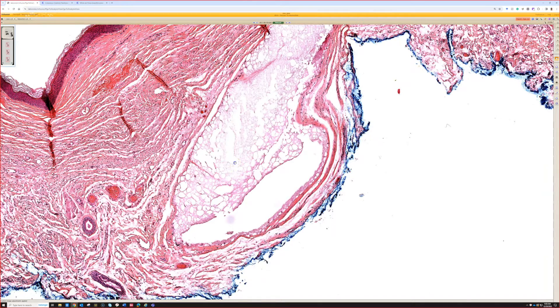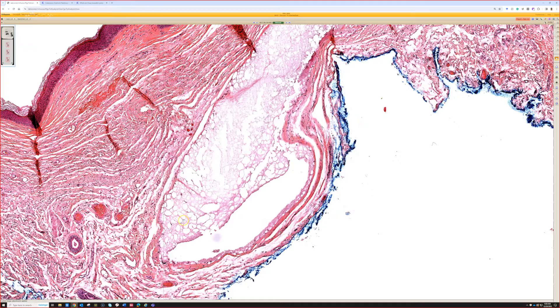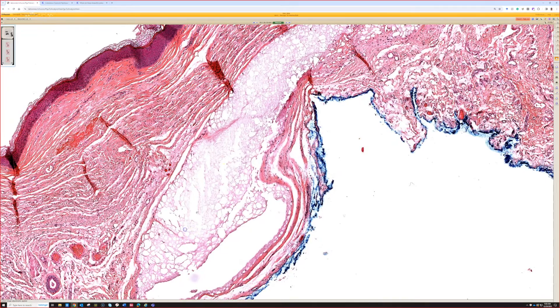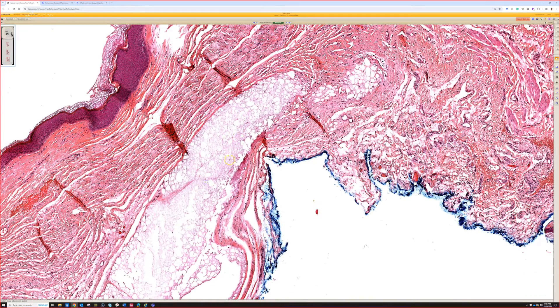Kenalog or triamcinolone injection. It's bubbly because corticosteroids are lipid-based, right? And so some of it washes out, but some of the material stays here.